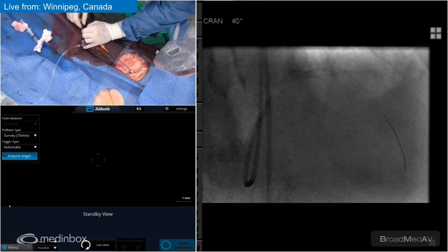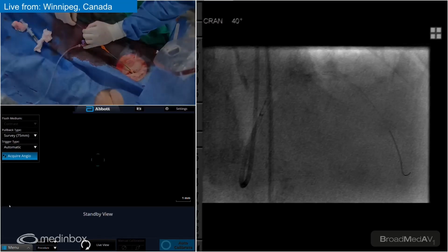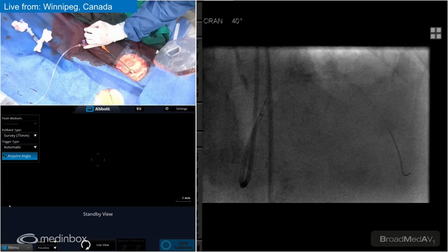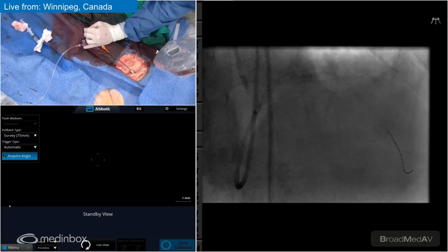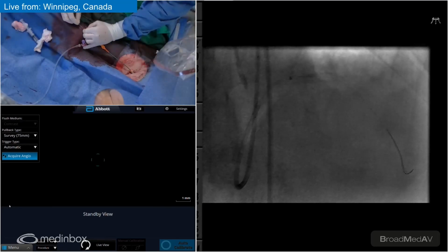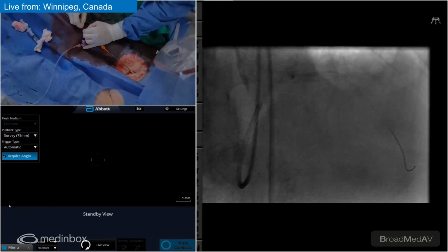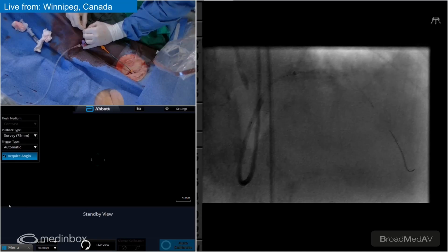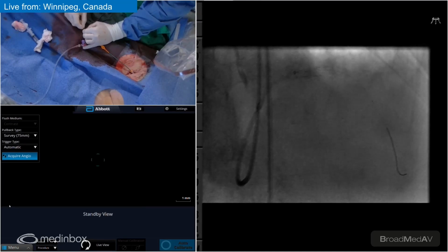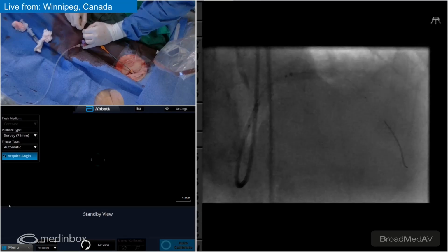Perfect. Let's see if I can get my wires untangled so we don't transmit the loop right into the. Just straighten that out a bit there, Jen, for him. There we go. Beautiful. I think that part is a good part. And again, I'm very cognizant about not damaging my stent. I'm not 100% sure how it's expanded, so I want to make sure. It's a hard time coming out of that loop when I kink it. Any traction on the wire? Yeah, let's do that again.